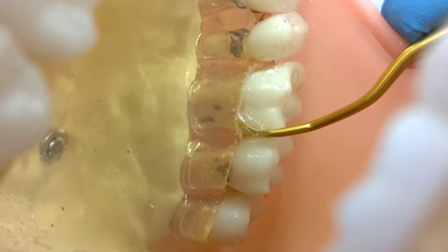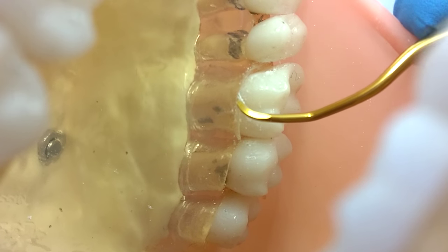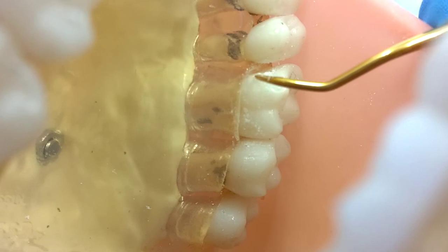Instead of the usual switch to the 11-12 instrument, the double Gracie transitions easily from the distal all the way around to the mesial.